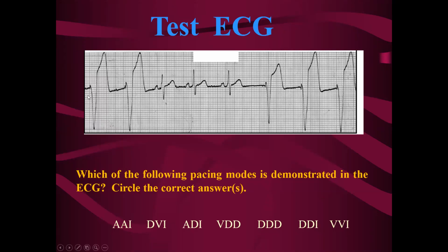So looking at this ECG, we want to first identify which chamber is being paced. We certainly see some wide QRS complexes. Sometimes the pacing spike is not a classic textbook pacing spike. It could be a tiny spike, but the fact that you have a regular wide-complex morphology with a tiny spike in front suggests that this is pacing in the ventricle. The interval between two consecutive pacing spikes defines the low rate of the pacemaker at this time. We also see some P waves and intrinsic QRS. Whenever there are those wide QRS complexes, I don't see any P wave in front of them. So what we have here is the presence of ventricular pacing.